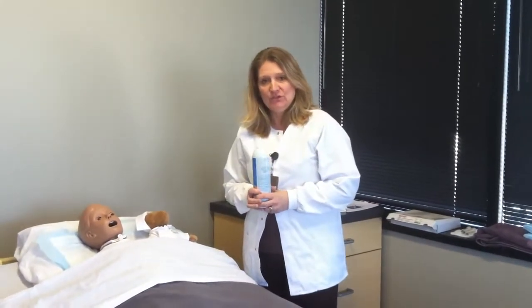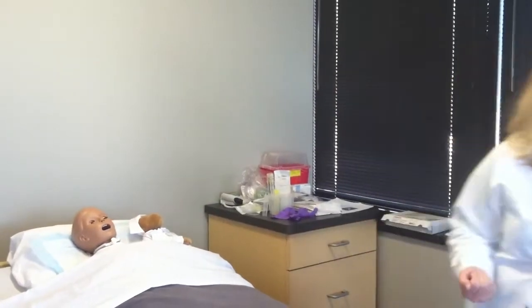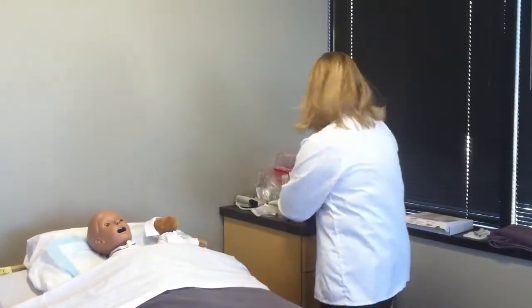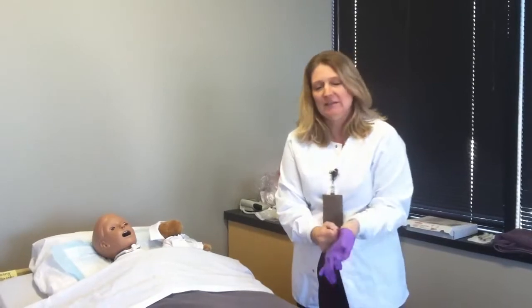I'm going to teach you how to do GTube Care. There's two different techniques. I'm going to teach both ways so that you can practice them. So the first thing you're going to do is hand hygiene. And then we're going to put on gloves, and make sure that you have all your supplies gathered.